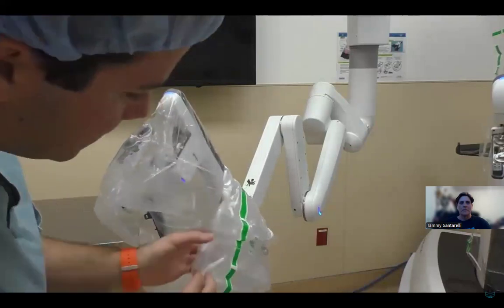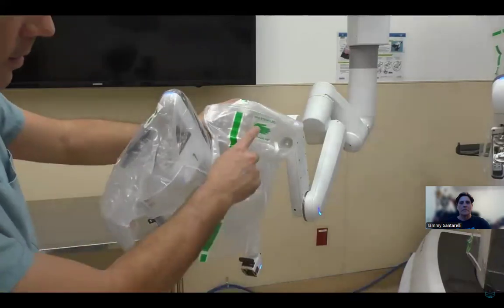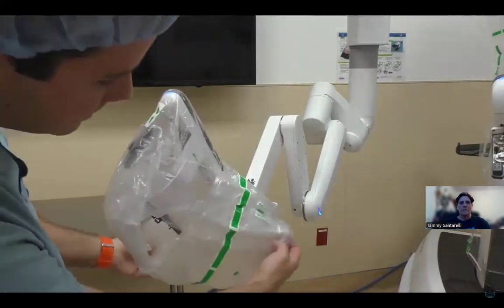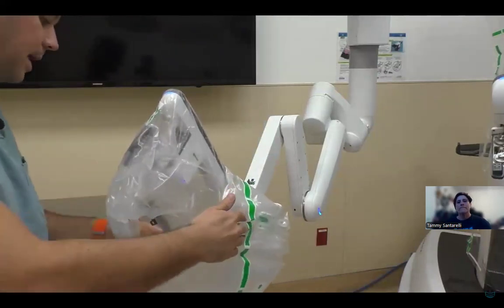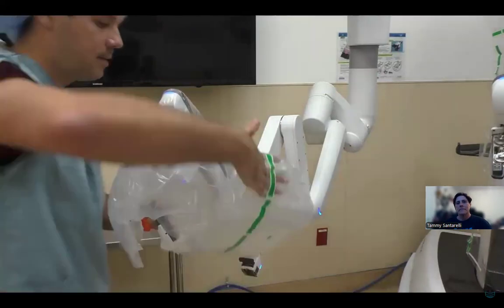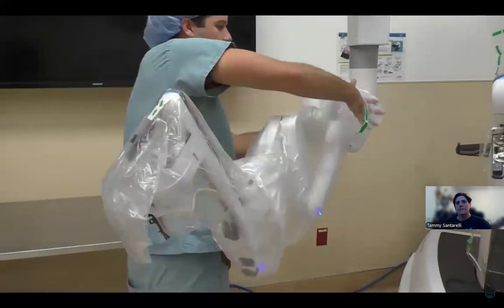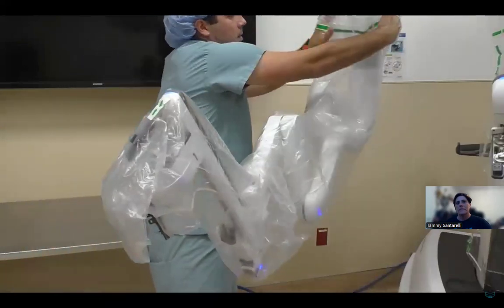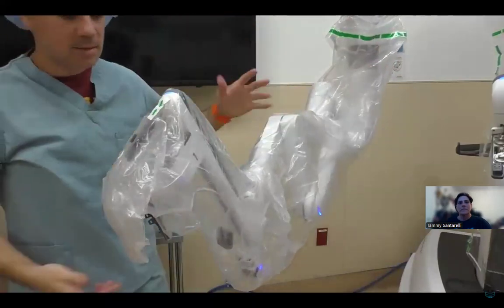Next thing you need to do is you'll notice that on the drape, we have two little hands. We have a hand here, we have a hand here with our magnets above each hand. That's telling you that you need to take both of your hands and slide them in these cuffs. You're going to then pull the drape all the way up the arm and attach the magnet pedal. It's as simple as that.